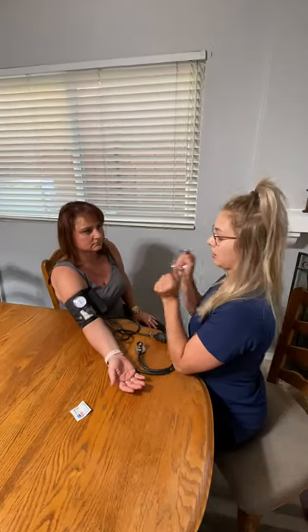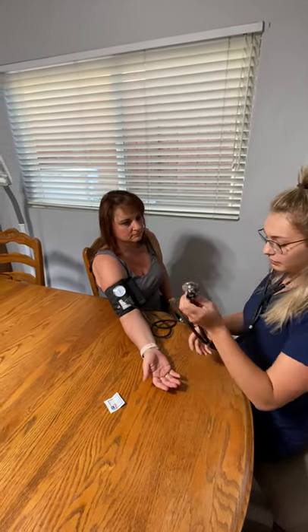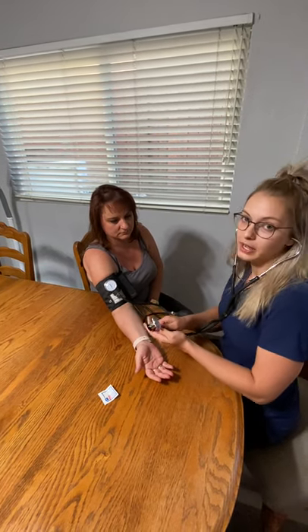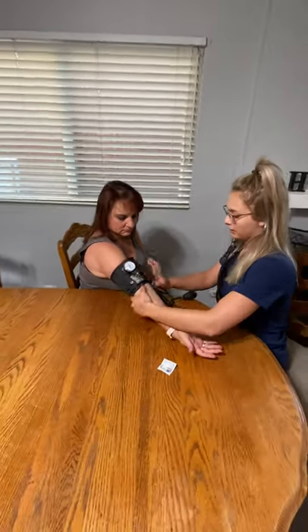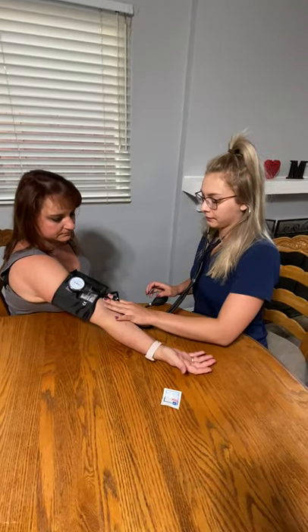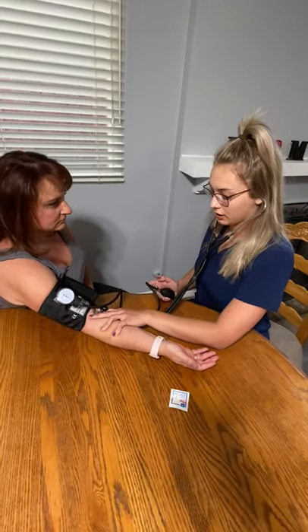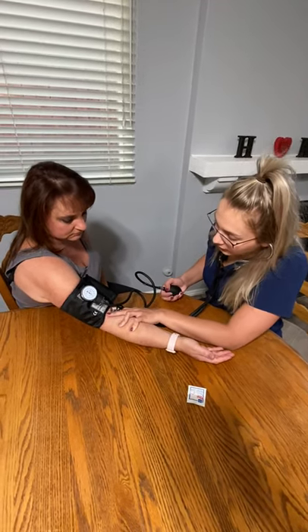Remember, the ear pieces are pointing away from your body — put those in your ear. You might want to start practicing in a quiet room so you can get your ears trained. Palpate the artery; I can hear it pretty clearly. Make sure this valve is all the way shut before you even start. Make sure you can see the sphygmomanometer dial, and here we go.